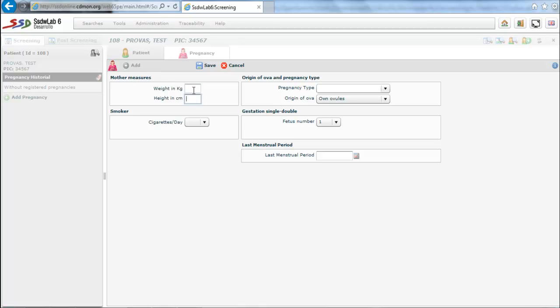We introduce the weight of the patient, which is a correction factor. The origin of the ovum and the pregnancy type, we leave the default option. And the number of fetuses, in this case is a single fetus pregnancy.